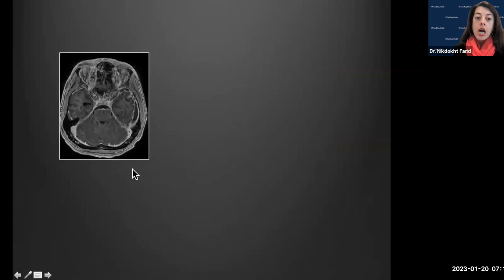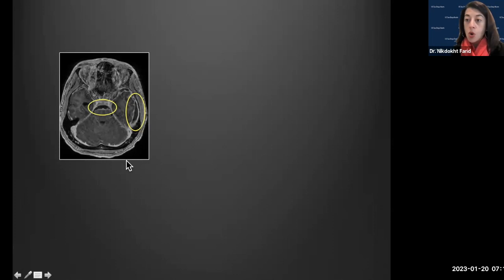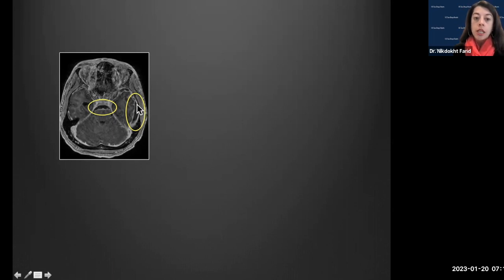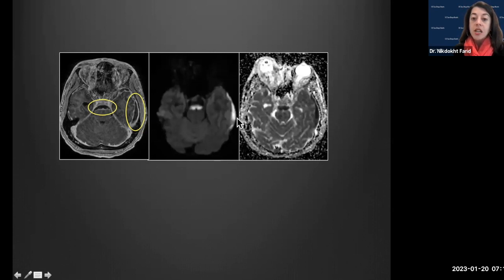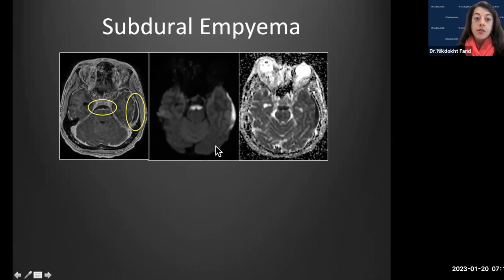Next, on axial T1 post-contrast, we see crescentic-shaped collections along the temporal convexity and anterotemporal convexity, as well as along the prepontine cistern. On DWI and ADC these collections show restricted diffusion — this is pus — making this a case of subdural empyema.